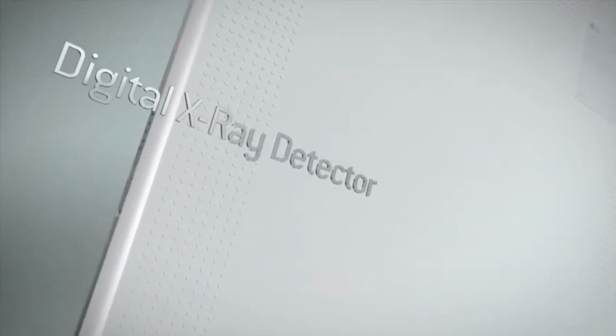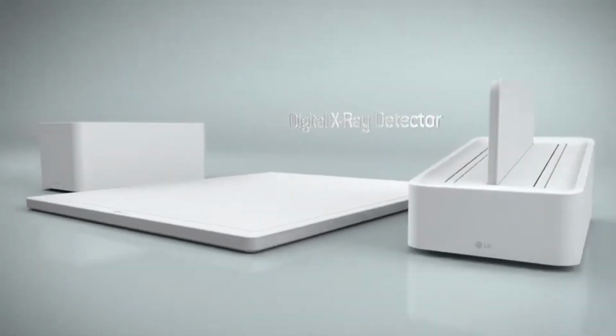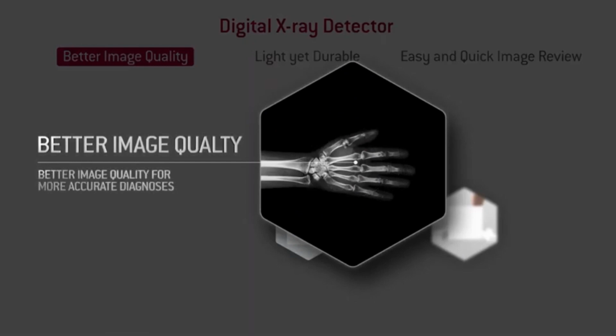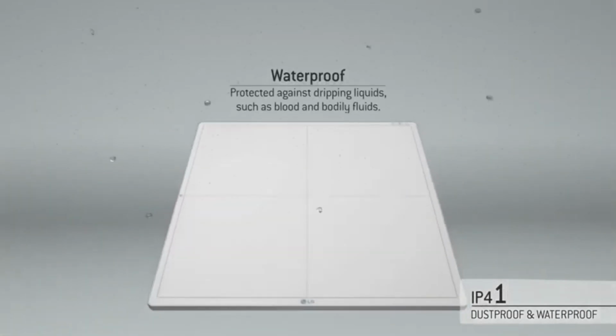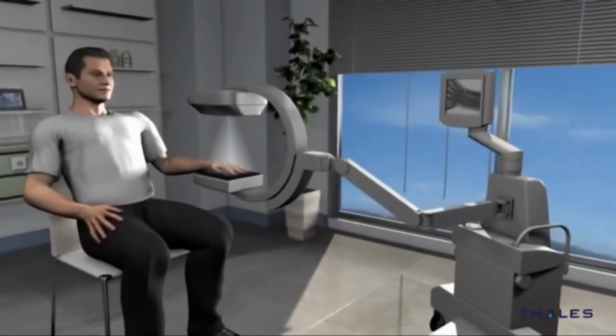In flat panel detectors, X-rays pass through the subject being imaged and strike one of two types of detectors. First, we will look into indirect detectors. Indirect detectors contain a layer of scintillator material, typically either gadolinium oxysulfide or cesium iodide, which converts the X-rays into light. The signals from the photodiodes are amplified and encoded by additional electronics positioned at the edges or behind the sensor array in order to produce an accurate and sensitive digital representation of the X-ray image.